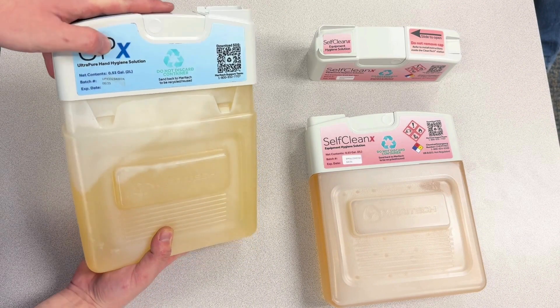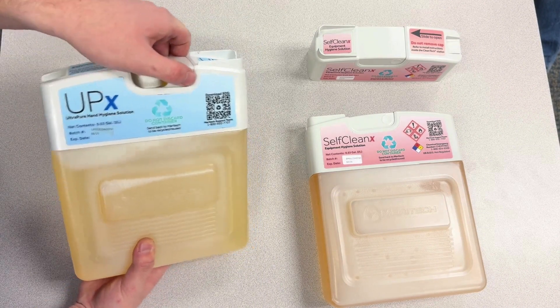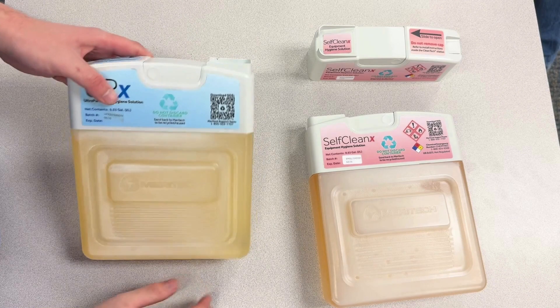To insert the cartridge top, all you're going to do is line it up and push down. Make sure you can open and close it, and you're good to go.